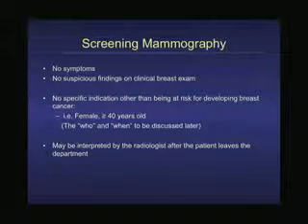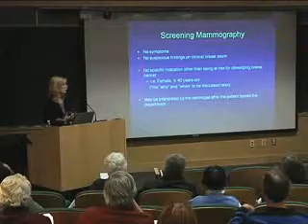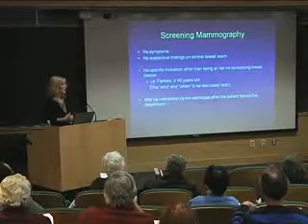And it can be interpreted by the radiologist at the time when they're there, or most of the time it's actually more efficient to just batch read them after the patient leaves. So it's unusual to actually get your result right when you're there, though that can happen. Most of the time you'll get a report later with the results, and we'll read those later on.